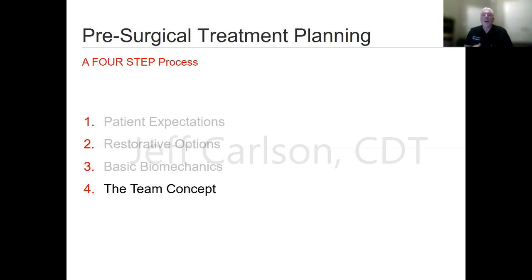The other is it helps them, because you're referring to them since they're obviously experienced in doing this, and they'll look at the expectations: no movement, not coming out of my mouth. And maybe you didn't have enough experience to talk about 5 implants and that poor quality D4 bone. The surgical clinician knows, I need to have this conversation with the patient because we're going to need to put in more implants than maybe what they were anticipating.